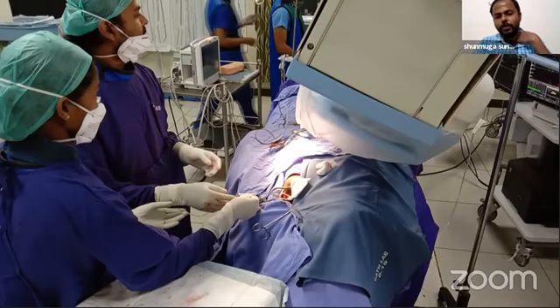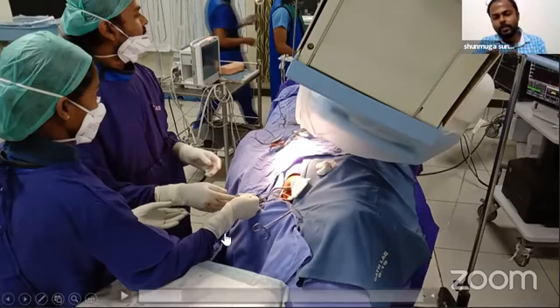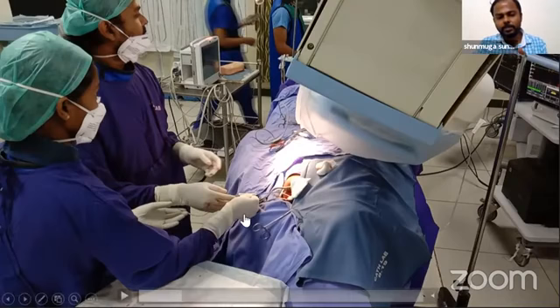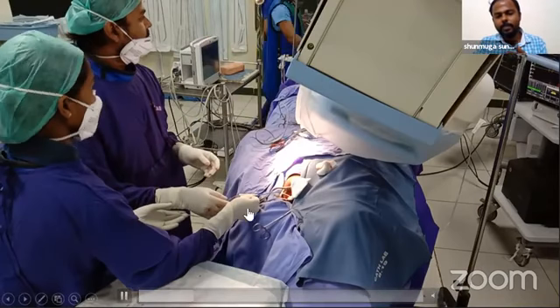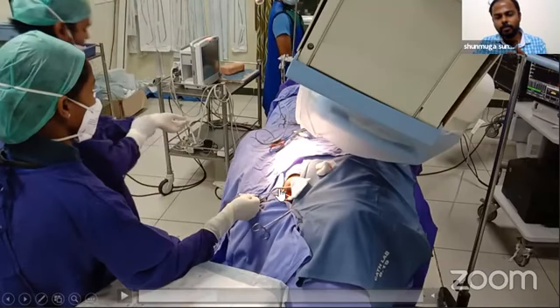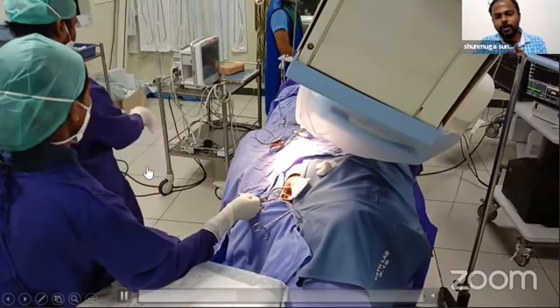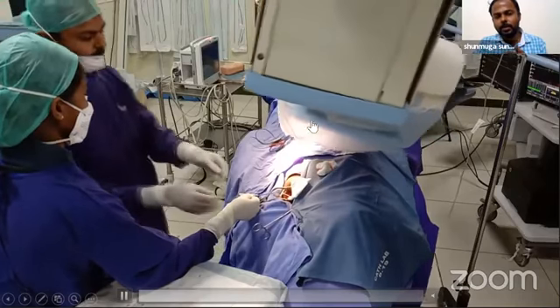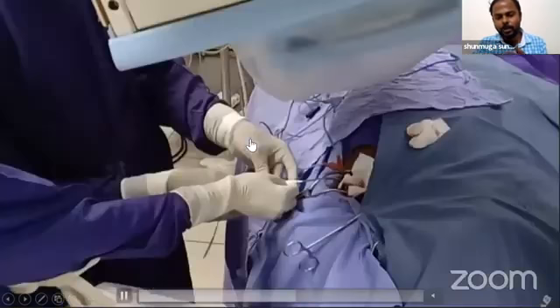So what I usually do is, I usually have this lead perfectly dry and my hand also perfectly dry, so that whatever turns I'm giving will be effectively transmitted to the other end of the lead. So see here, once I'm comfortable that I'm going to screw in the particular area, my fluoro is still in the RAO view. Once I'm ready to screw, I usually remove my glove and wear a fresh single glove, and I will move my fluoro screen to the LAO view.